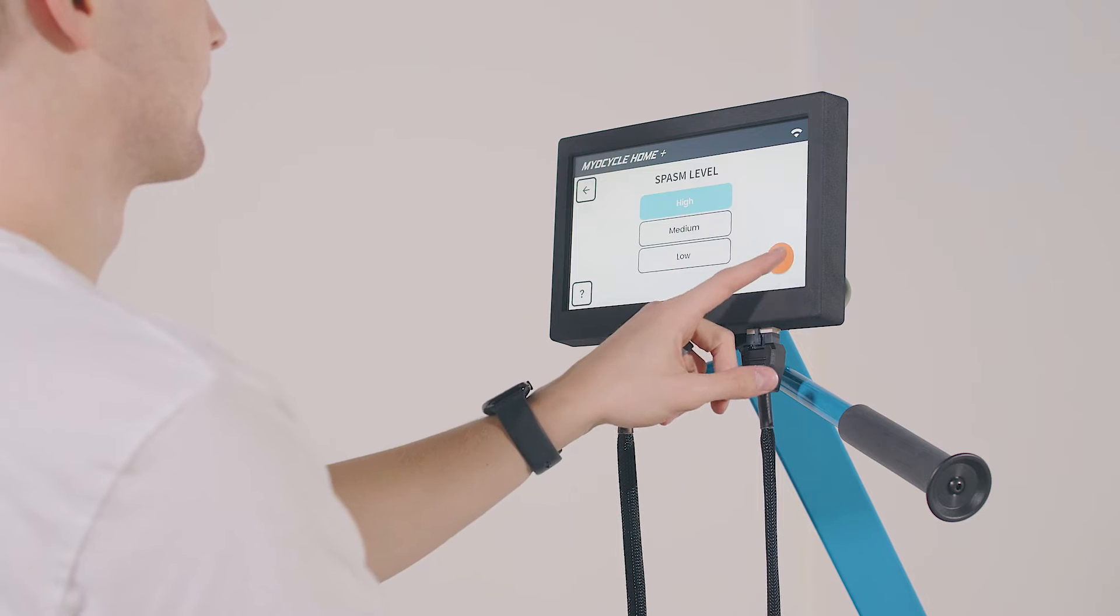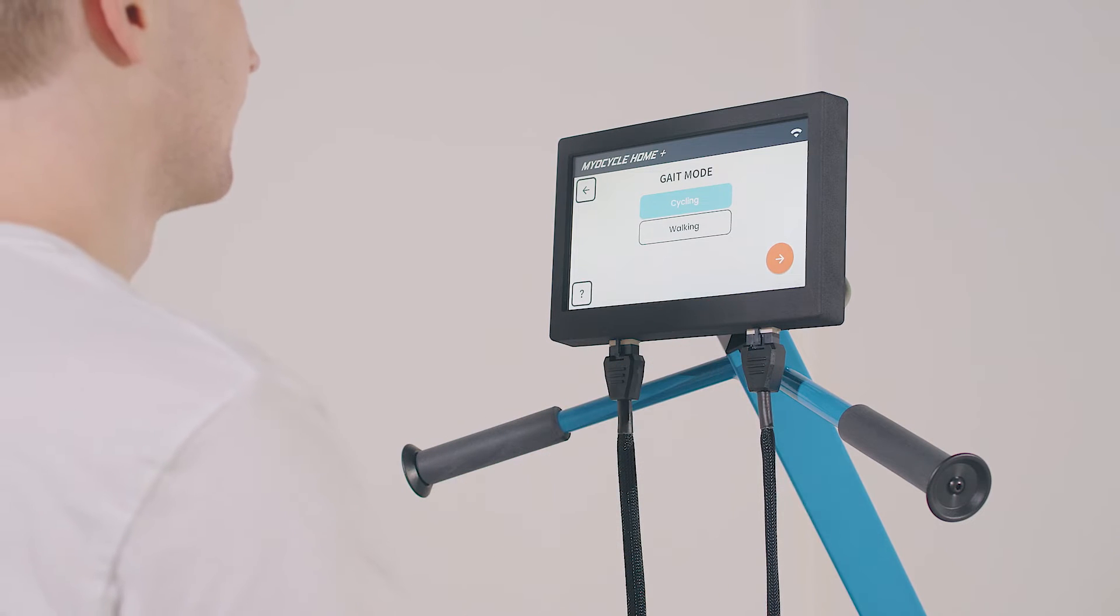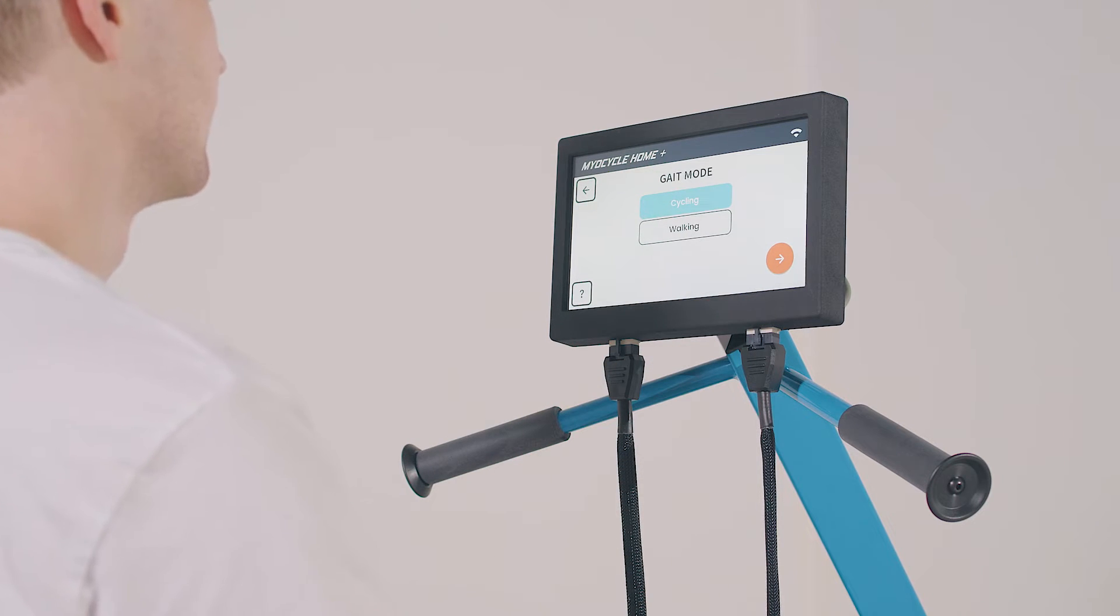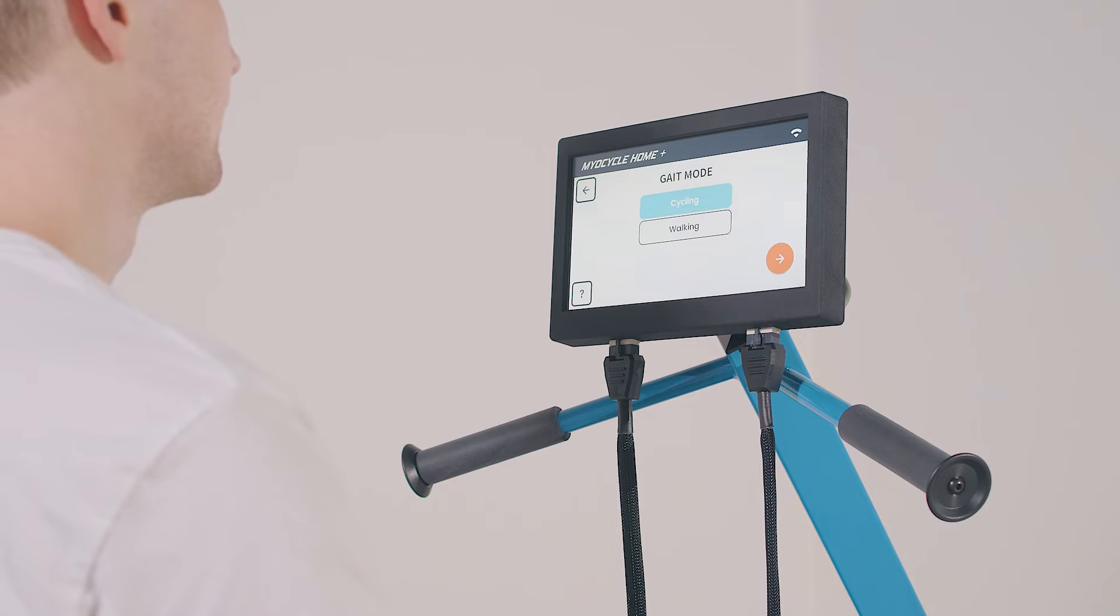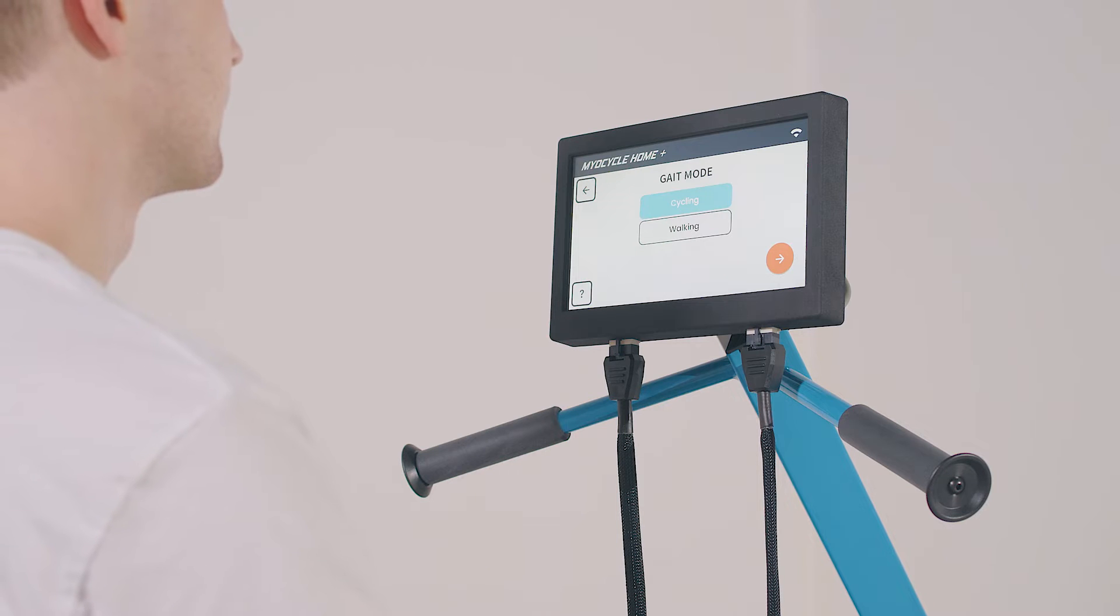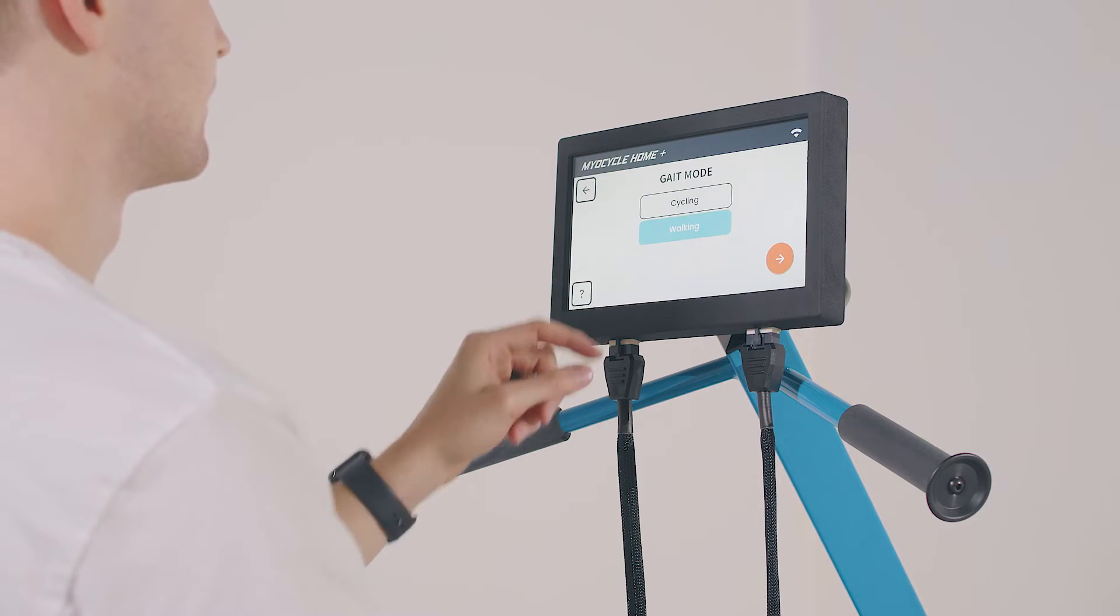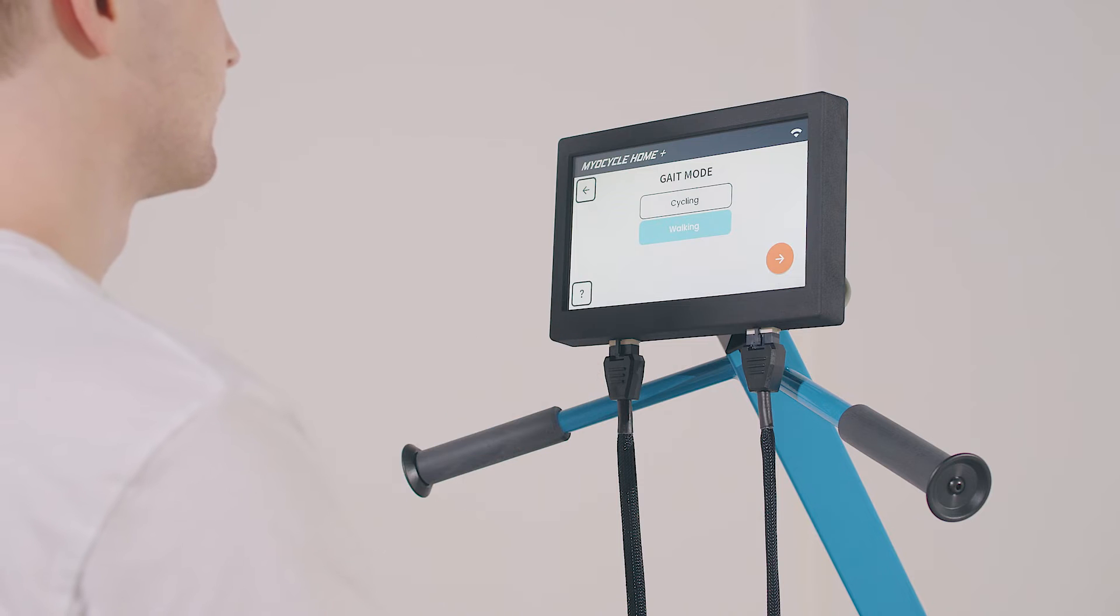If you're using the MyoCycle Plus model, you'll also be asked to select the gait mode. You can choose cycling gait or walking gait depending on your therapy goals. We recommend using cycling gait if you are stimulating your calves and walking gait if you are stimulating your shins.